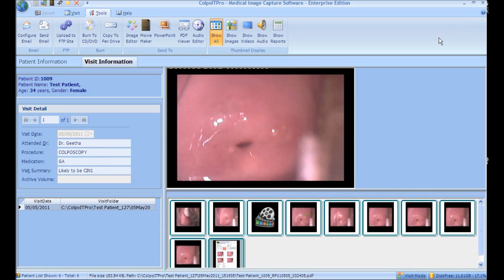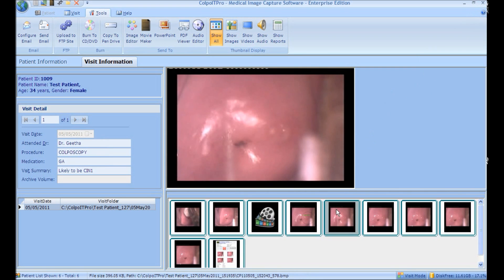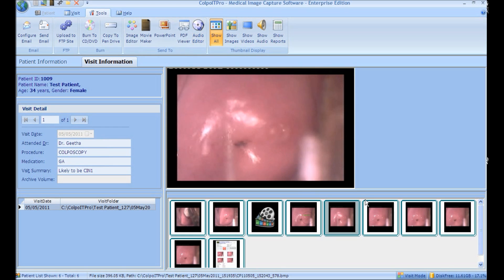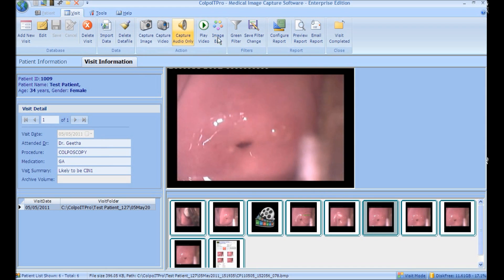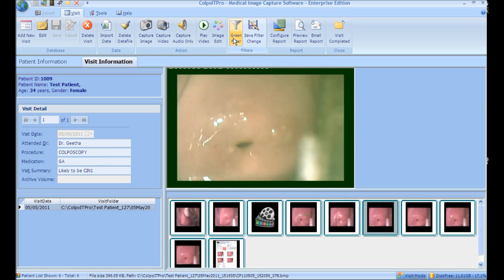Similarly, audio files can be edited using the Audio Editor. Green Filter: to apply a green filter to the selected image, click the Green Filter button. The intensity can be increased by clicking the button again. Click Save Filter Change to save.